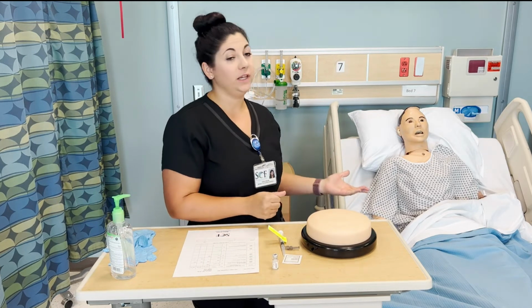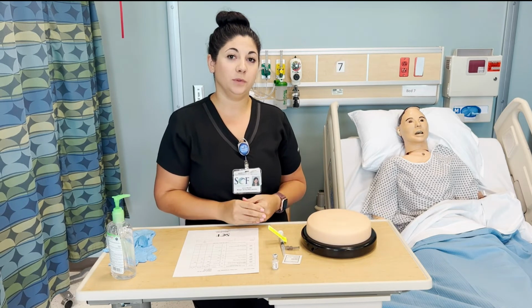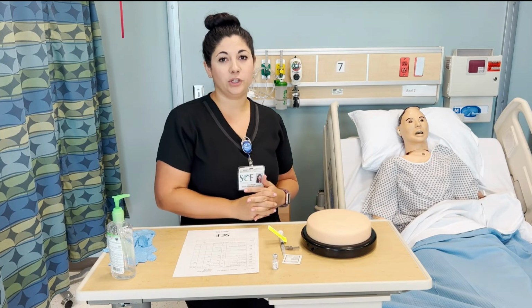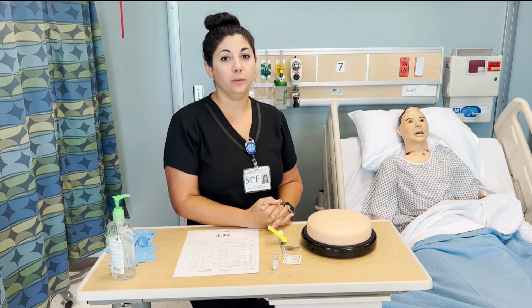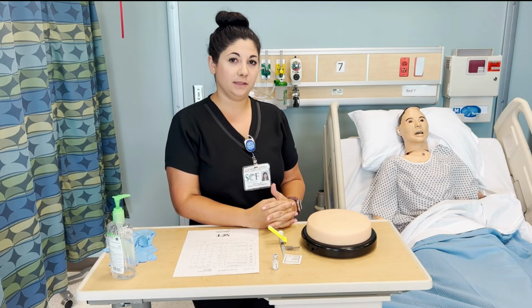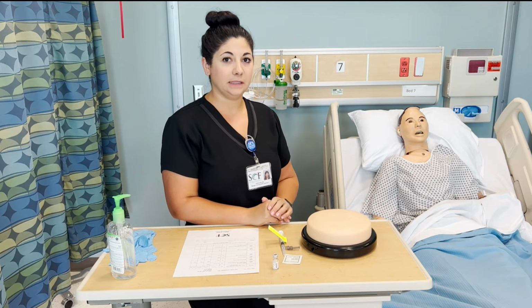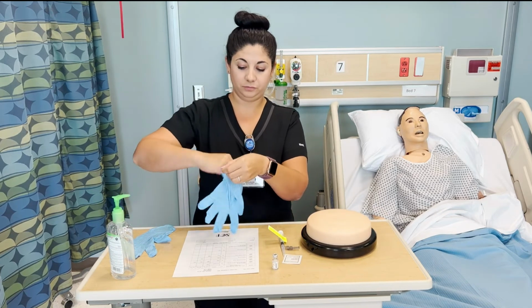I've explained to the patient using my drug cards what the medication is for and any possible side effects that they might experience. I'm going to collaborate with my patient on which site they would like to use, making sure that it is appropriate for the milliliter amount that I am giving. We can use the deltoid, the vastus lateralis, or the ventral gluteal. I'm going to position my patient so that they are comfortable and I can easily access the site and don clean gloves.